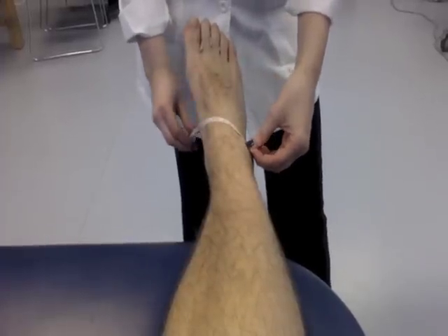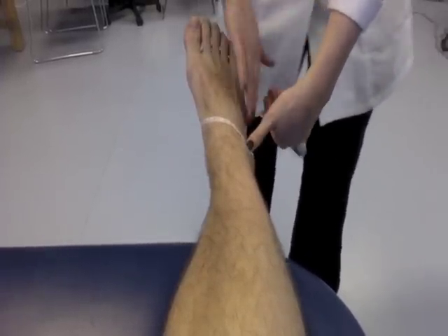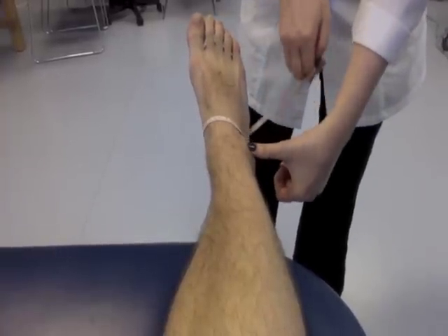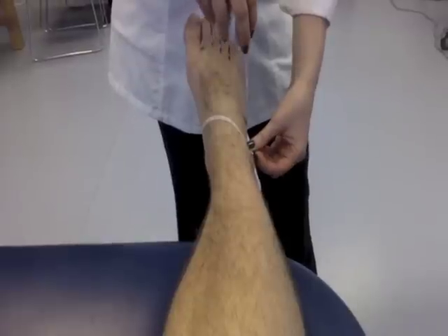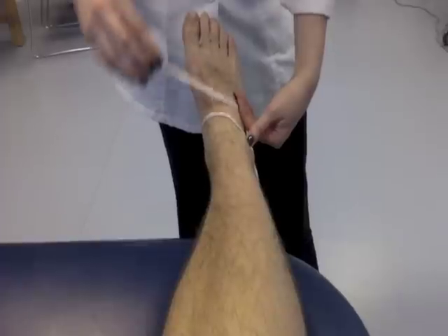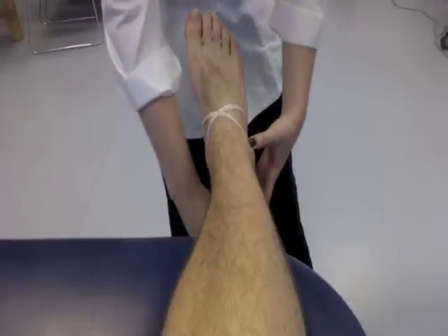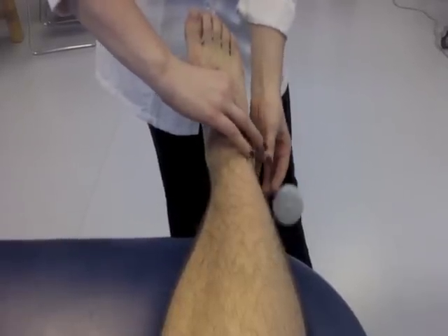The tape is then pulled across the arch, ending just proximal to the fifth metatarsal. Next, the tape is pulled across the tibialis anterior tendon, around the ankle, slightly distal to the medial malleolus. Finally, the tape is wrapped around the Achilles tendon, just distal to the lateral malleolus, and across where the tape began.